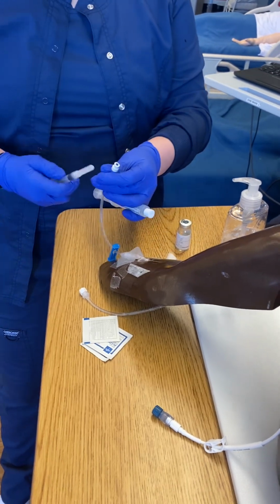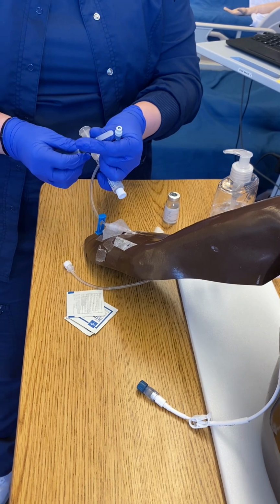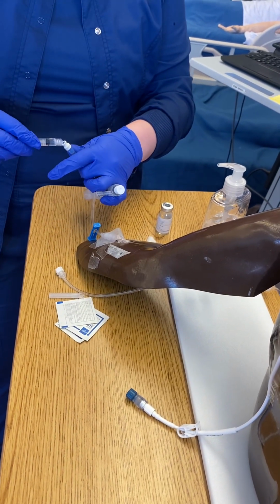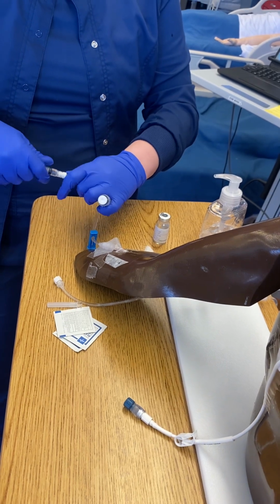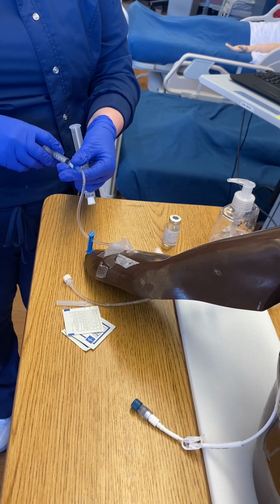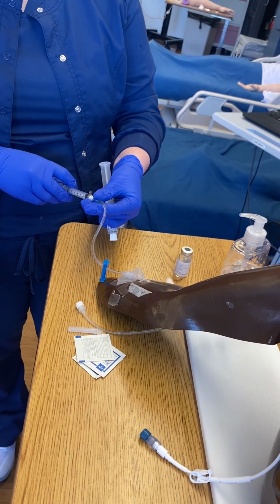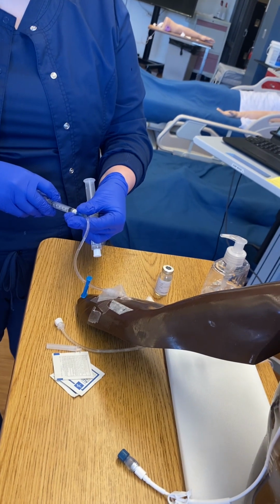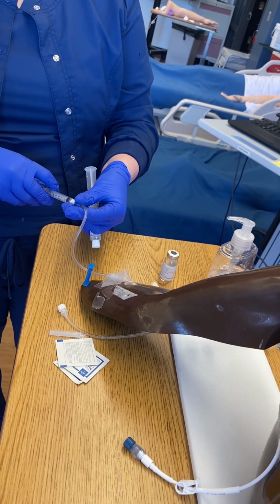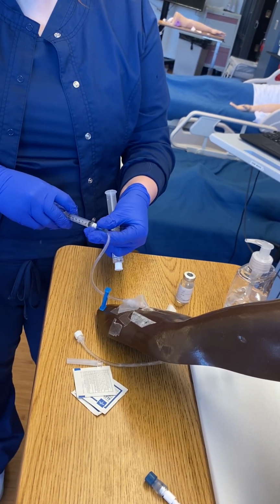Grab my med. Make sure I take it off with the blunt cannula. Attach the med. So since I have 1 milliliter, I want to do this over a minute. So I'm going to watch the clock. I'm going to start giving it now. And we're going to go really slow for a full minute. And as I do this, I'm watching for any patient reaction.